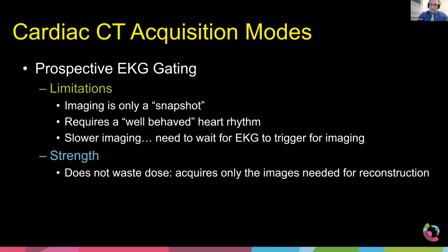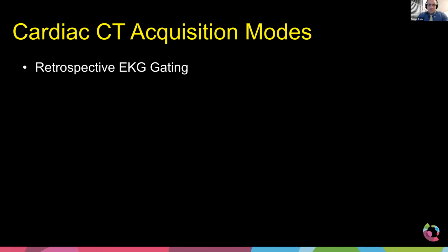Obviously, the strengths are we're not wasting radiation dose on collecting data where there would be motion, so the patient dosing is generally at the lowest in prospective imaging.